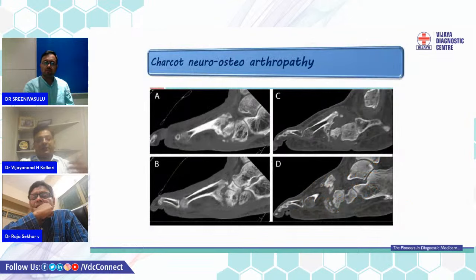What I can see on CT scan, the experienced person can see on X-ray also. So it depends from person to person, but for the general population or general clinicians who are not very experienced in looking at the images, CT actually gives a slightly better edge because the information provided is slightly better.